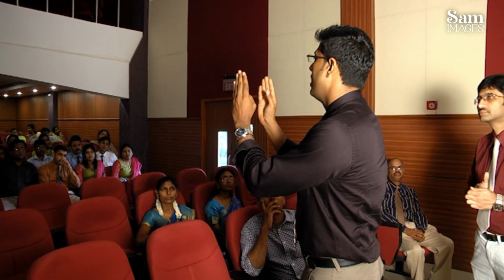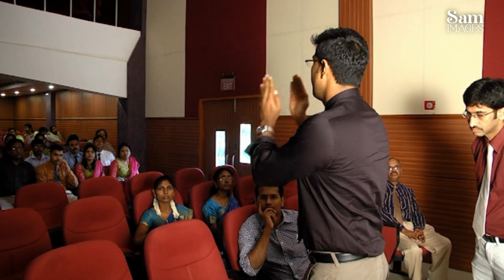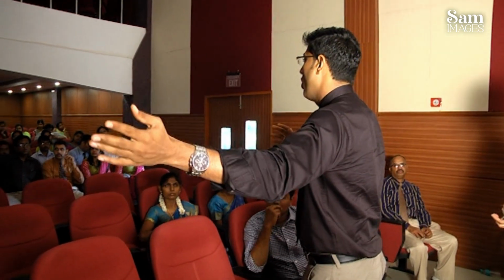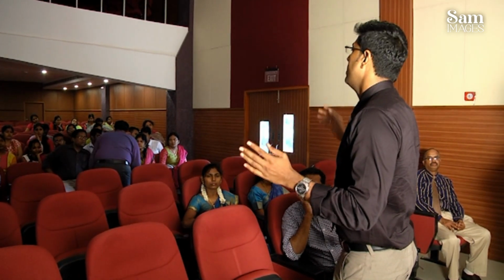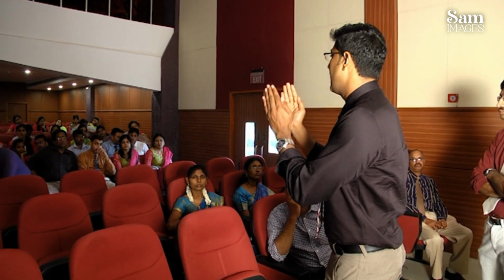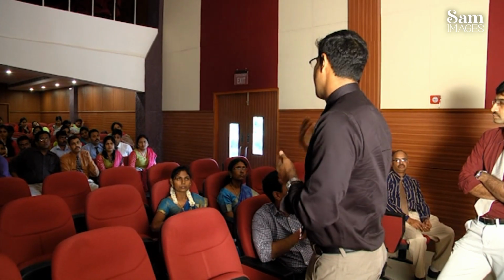Say around plus 20 to minus 20, something similar to that. So this scale can be moved up or down. Basically, you can't say to the computer detect velocities from 0 to say 300, 400 centimeters per second. It can't do that. So every time you'll have to set a velocity scale. Within that scale, whatever velocity the vessels fall into will be detected.